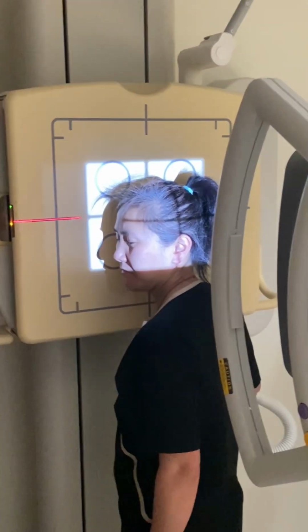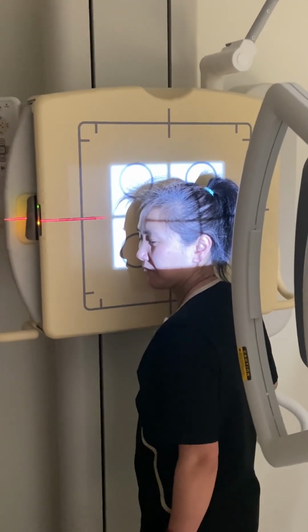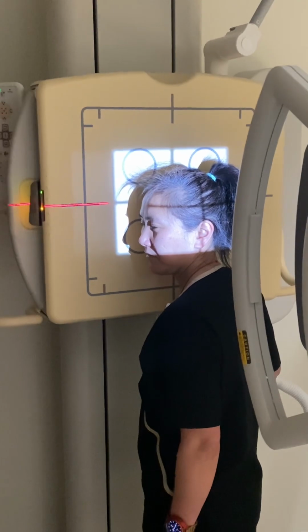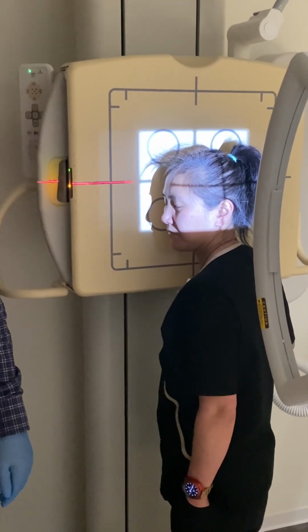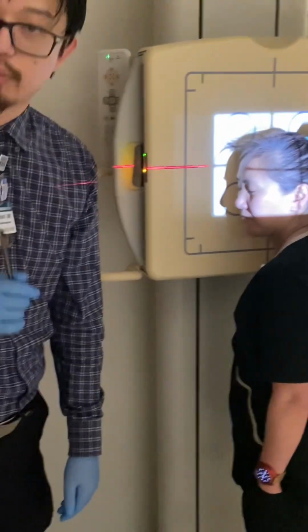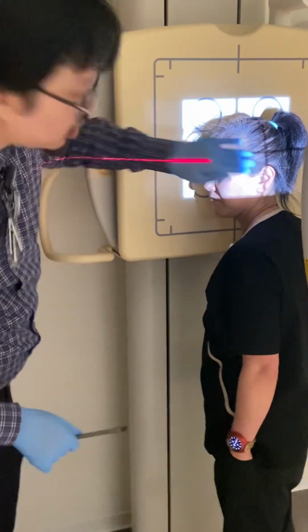Chin down. Minimum OID. Minimum. We still have a little bit. So some patients will have some OID, but remember positioning is more important than OID. Okay. It's okay to have some OID as long as you have the perfect positioning. Okay. All right. And then notice we're still 2 inches above that EAM.